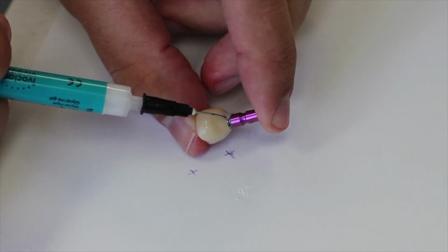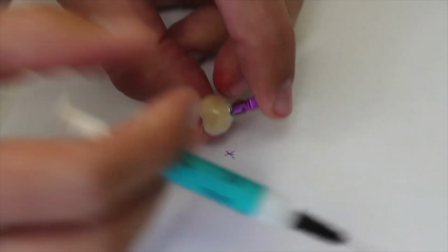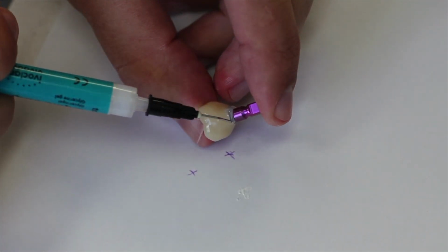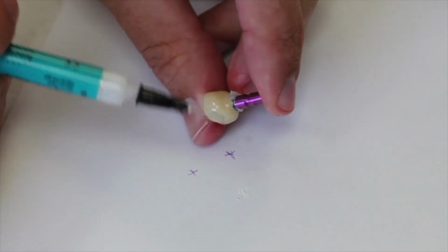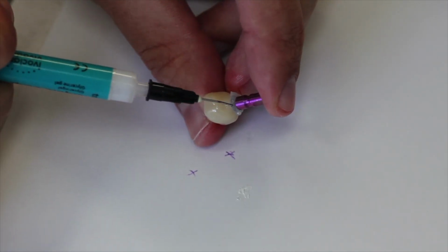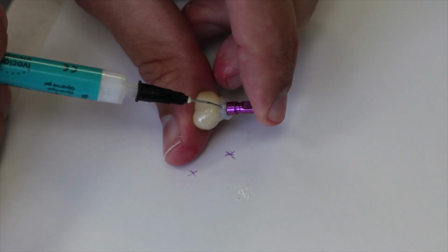After initial cleanup, it's important to apply a glycerin gel to the cementation joint to prevent the formation of an oxygen inhibition layer. In this example, I'm using Liquid Strip from Ivoclar Vivadent. You want to cover the cementation joint completely in preparation for final polymerization.